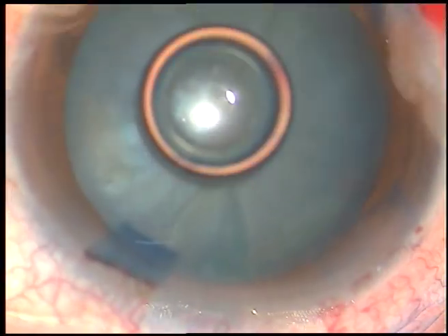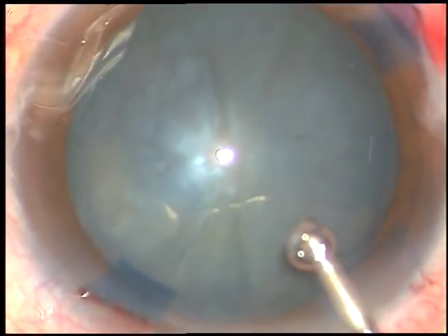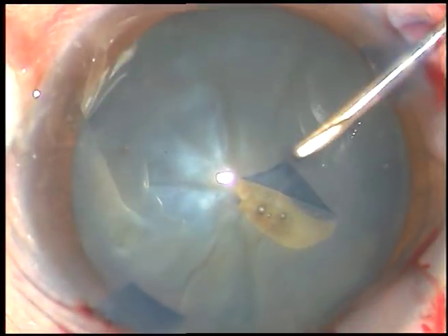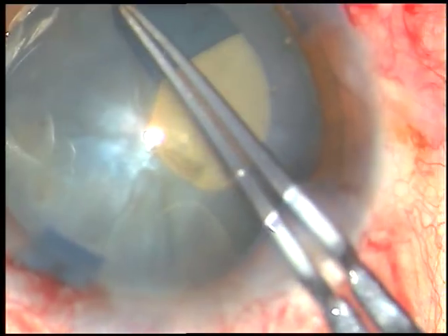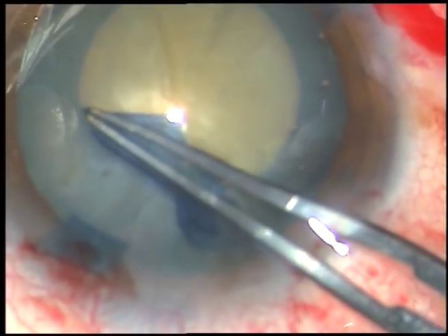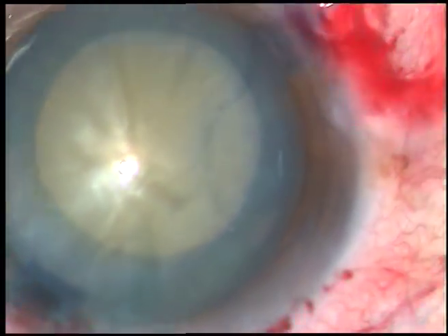And now, viscoelastic substance is being used — it is 2% hydroxypropylmethylcellulose. I don't use sodium hyaluronate; I am not against it, but I don't use it. And now, just after puncturing or incising the anterior capsule, I see that there is no leakage of fluid, indicating that intralenticular pressure is not raised. I am planning a rhexis of adequate size. This is not a large rhexis because there is some convexity of the anterior capsule, so this is about a 5-millimeter rhexis.